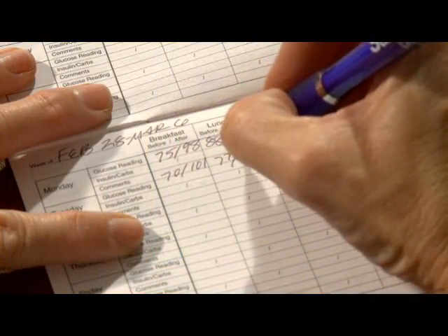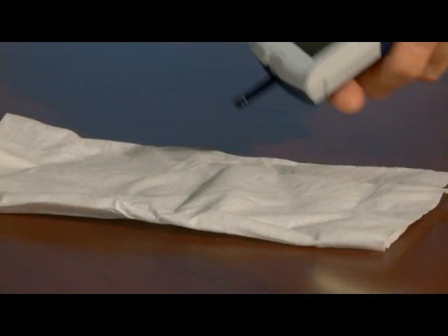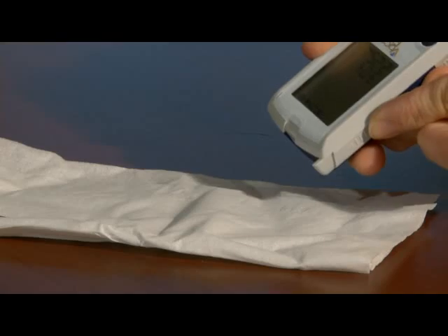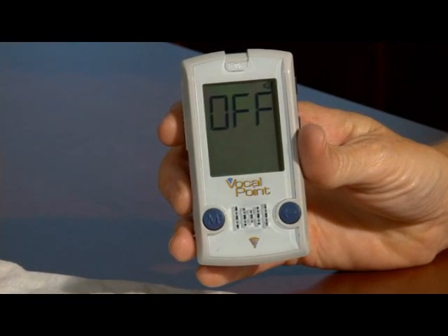Record your result in the log book provided. Use the strip ejection button on the left side to dispose of the used test strip. Once the strip is removed, the meter will turn off.